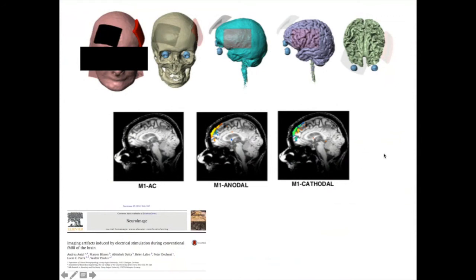This is a study in a cadaver done by Andrea Antal and colleagues in Germany. What they did was just look at signal change during stimulation, and they saw some BOLD signal change. This was a cadaver, so obviously this was artifactual. It does raise some questions as to exactly what we're seeing with concurrent stimulation and imaging. It's an interesting question to deal with and one we're not entirely sure about.